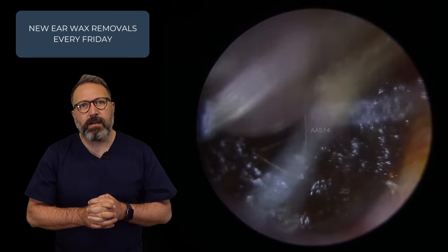Look at this one — we have a very, very full ear canal. It's got a bit of a sheen to it, which means it's either soft or it's really hardened up. It's hard, it's tough as old boots. The sheen you can sometimes get is when you put a little bit of olive oil on there and it causes the light to bounce back. Nipping over the top — it's a weird texture, this one. It's got a bit of a harder outer shell, but a little bit softer on the inside, like an armadillo. So we'll just pull this away and you'll see how that softer section on the inside almost kind of unravels, while the harder shell stays attached to the canal wall. You can see where the Jobson Horn is taking this sort of gully form now in the middle. I'm going to gently see if I can get to the harder section behind that — there was a little bit of a gap. Now we pull forward — oh my gosh, this hard outer crest. It's all starting to move forward.